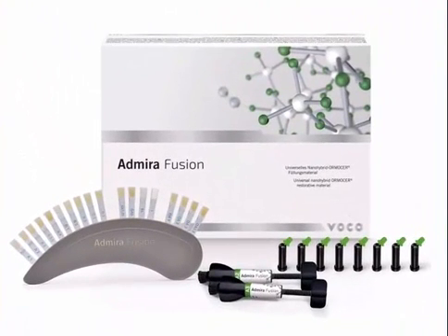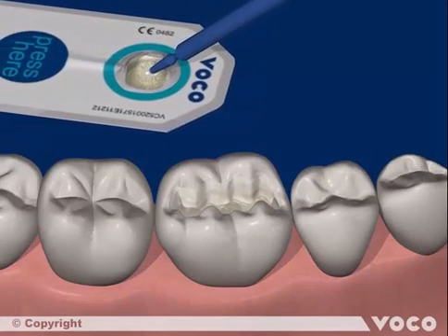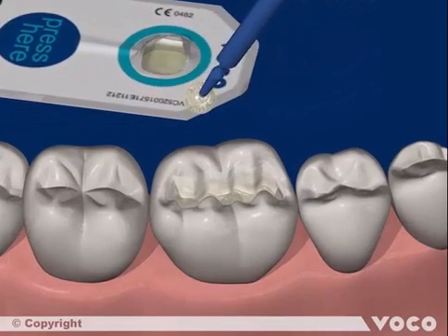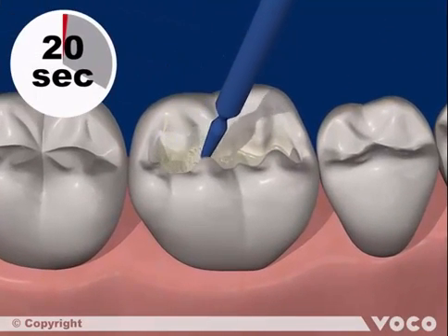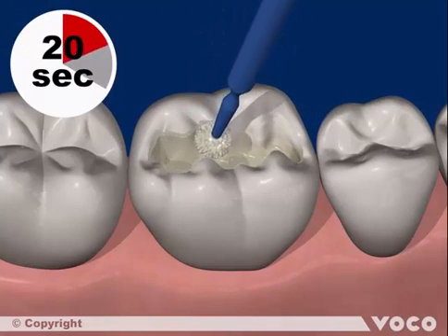In the following, we will show the filling of a Class 1 cavity with Admira Fusion. Cavity preparation, cleaning, and drying are followed by the application of the adhesive. Here, Futurabond U is used in self-etched mode. After activating and opening a single-dose blister, the adhesive is applied homogeneously to all cavity surfaces and rubbed in.